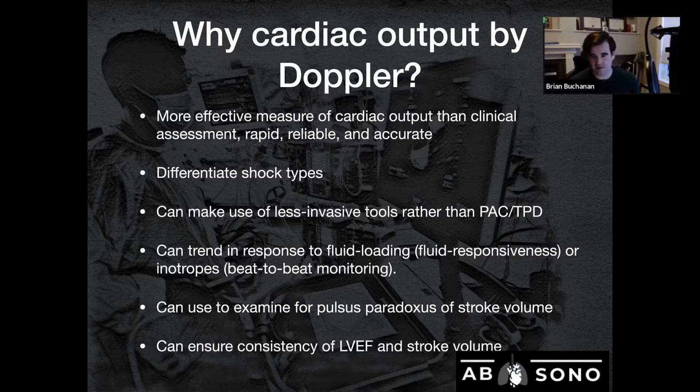And of course, I use it quite often for differentiation of shock types, for example. Obviously, it's less invasive, and you can trend it really easily, much more than, say, an ejection fraction can. Certainly, there is more of a time investment in learning the technique, but it is of value in terms of the actual input versus the benefits yielded.